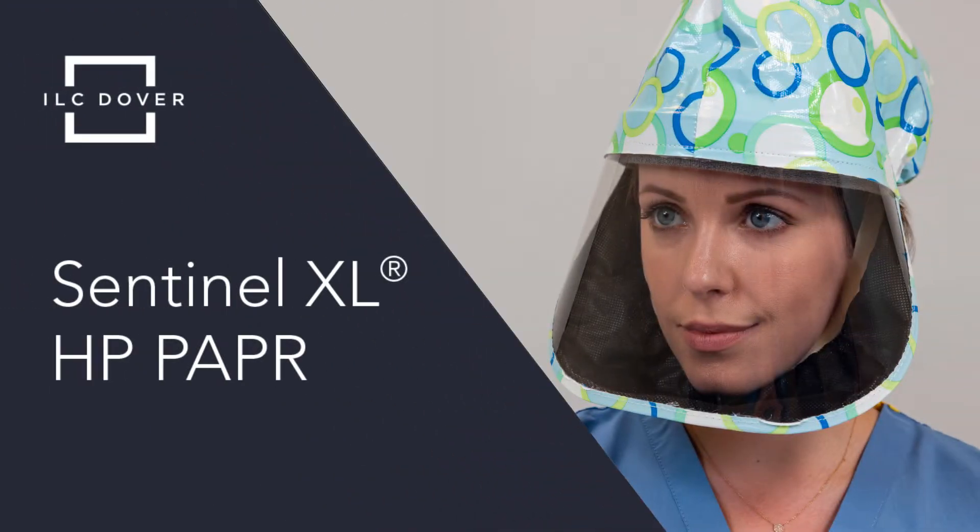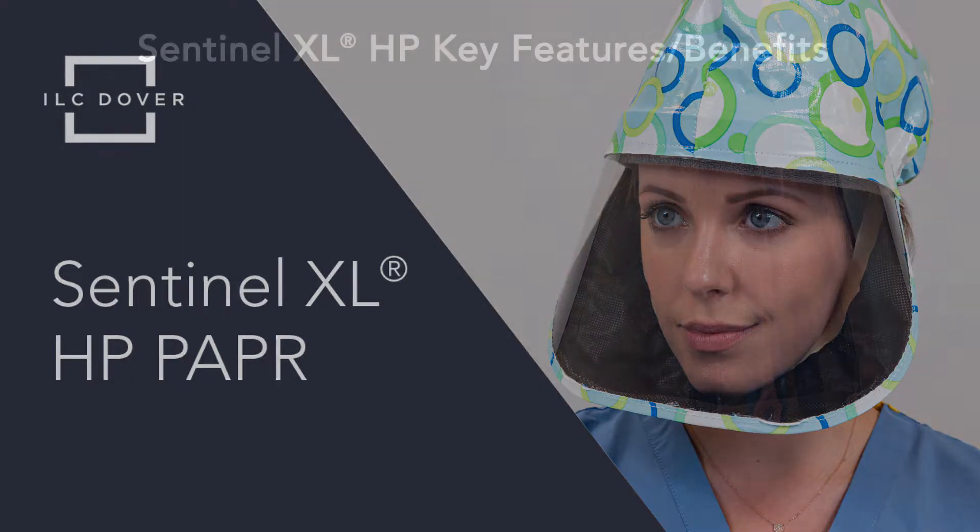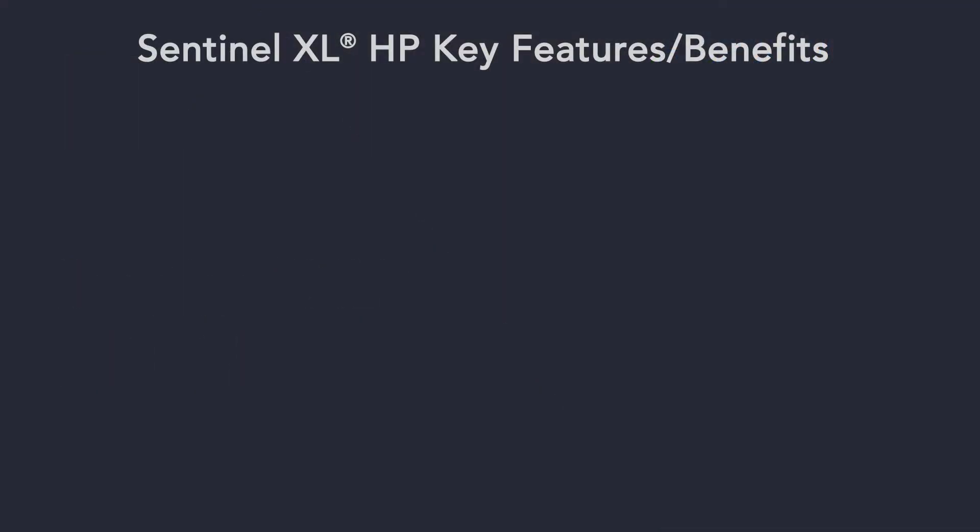Introducing the Sentinel XL HP, a high-performance PAPR specifically designed to provide health care professionals with superior respiratory protection against a range of infectious diseases. The Sentinel XL HP system offers compelling advantages over similar systems.